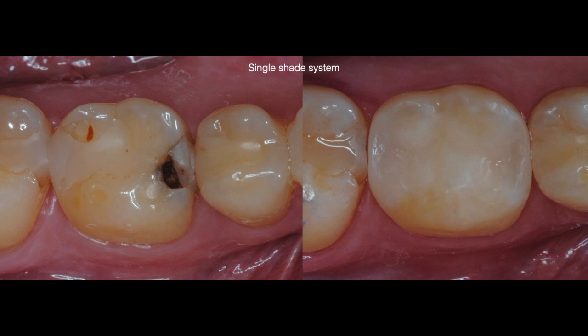Here are the before and after photos where we can observe a slightly lighter appearance of the restorative material when compared to the actual tooth structure, kind of like when you use an A1 shade. Personally, I think it is an acceptable match. It is important for me to say that both 29 and 31 were restored as well at a later appointment due to obvious reasons.